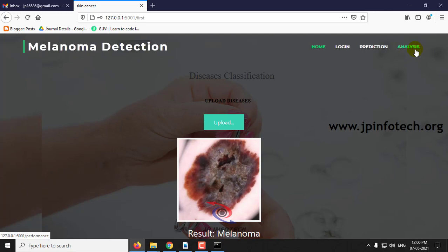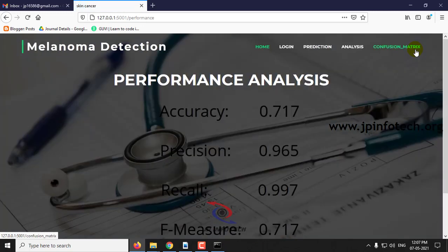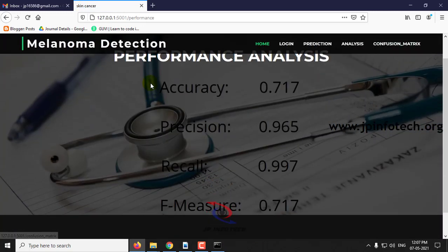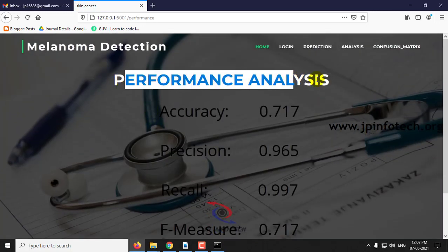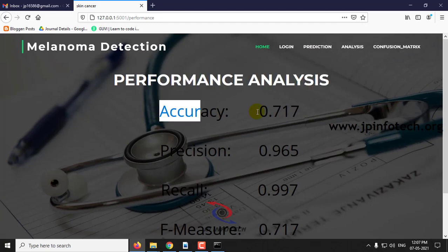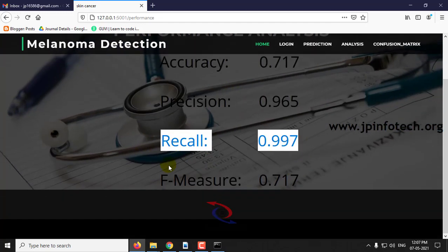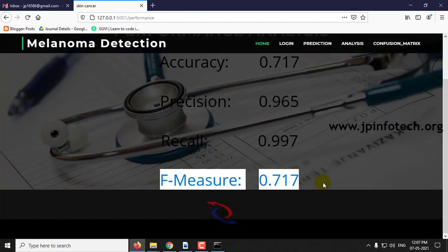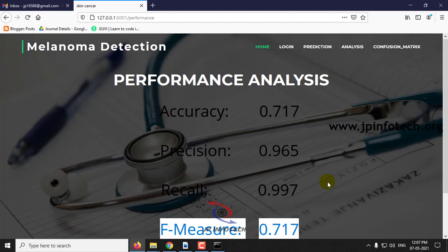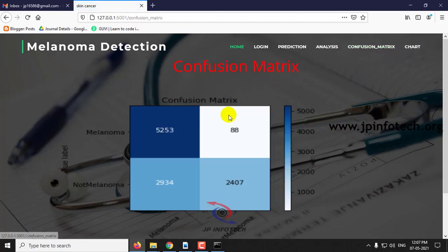After that, the prediction goes to the analysis part. Here in the analysis, you can see the performance analysis with accuracy value, precision value, recall, and F-measure. And then the last one is the confusion matrix.